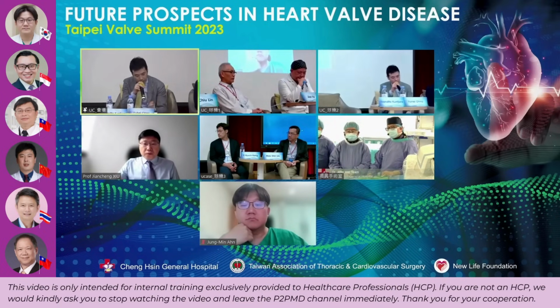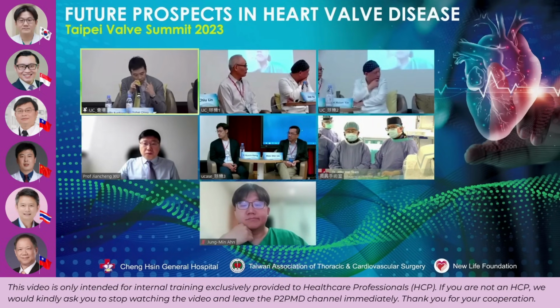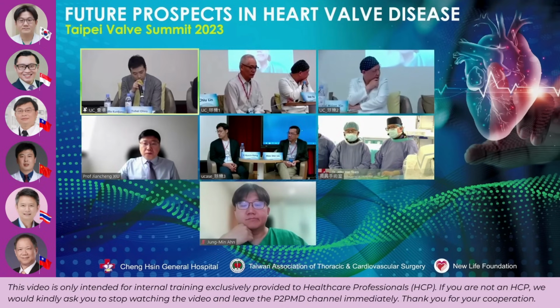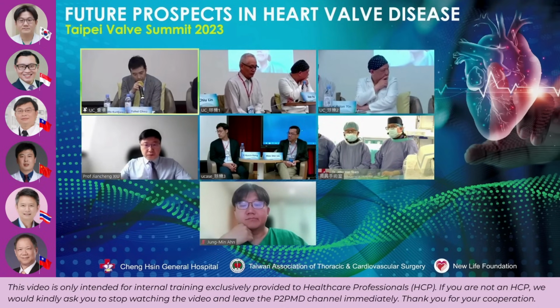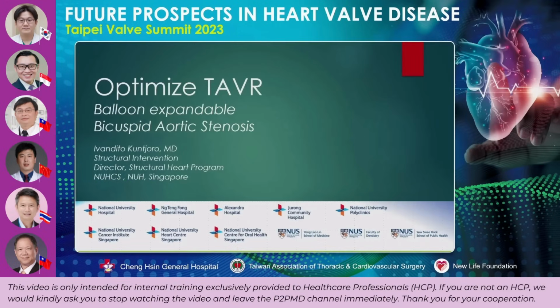For this specific case, as other experts have already commented, there is minimal calcium with AR as the dominant pathology. So I guess maybe we can apply rapid pacing during the implantation to facilitate stable implantation. This should be a very challenging case.